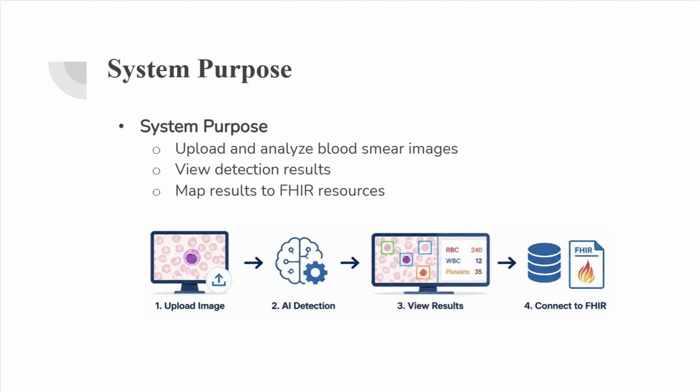Our goal is not to replace medical professionals. Instead, the system is designed as a proof of concept tool that could support faster review, better organization of results, and a smoother integration between image analysis and health records.